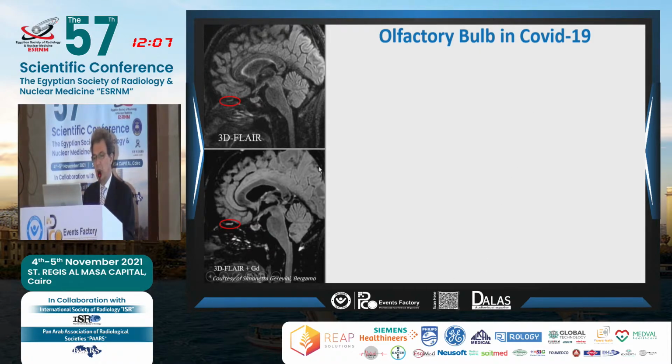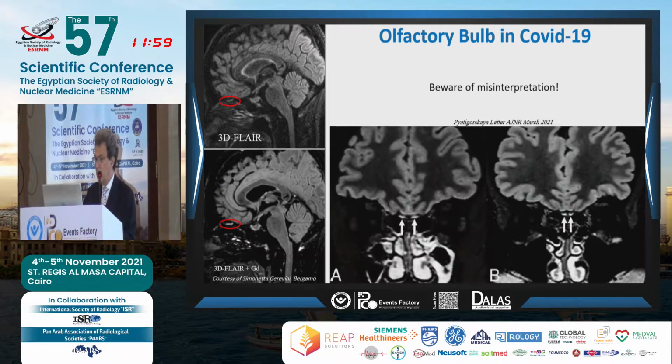Two more cases, one with a normal bulb and one with a hyperintense bulb. However, you have to be careful when you want to look at the bulb, because it has been shown that, especially when using FLAIR, you can get hyperintense signal as an artifact without the patient having any problems with the olfaction.